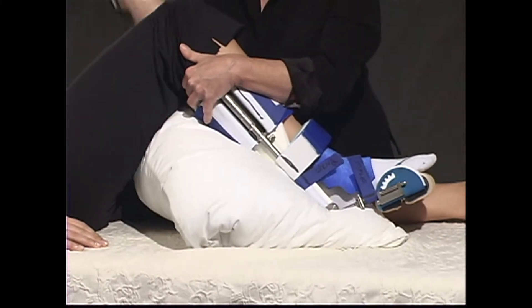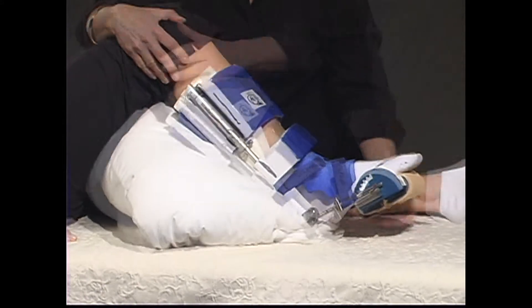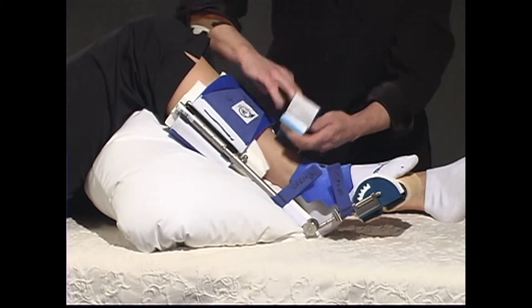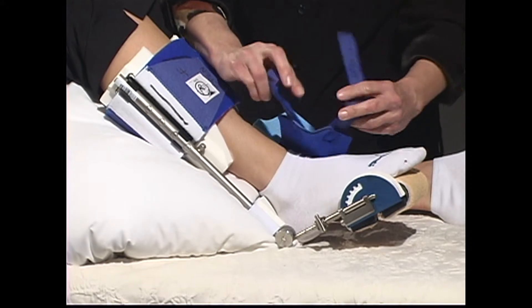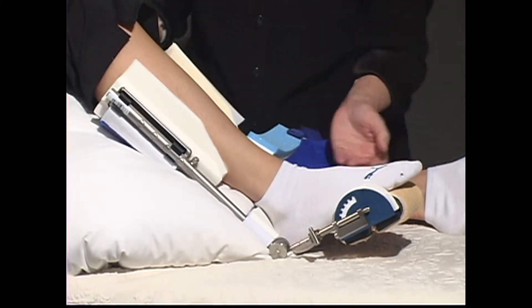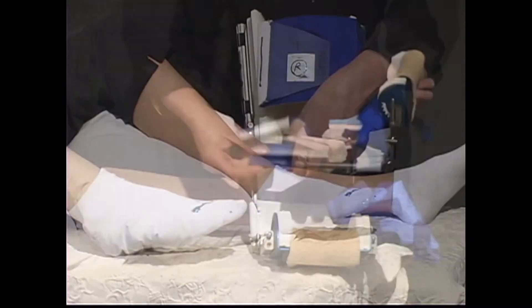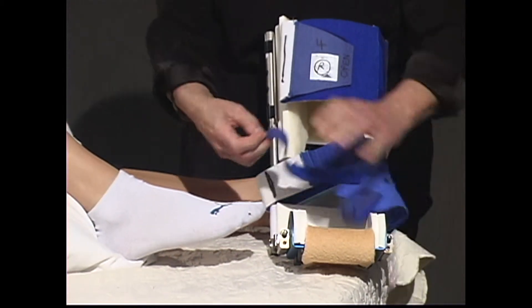Place a pillow under the patient's calf to float the heel. To remove the ankle DynaSplint, follow the numbers marked on each cuff by the sales consultant: first, the 2-inch shin strap, then the top thin blue butterfly strap, then the lower thin blue butterfly strap, finally the large shin cuff. Gently remove the patient's foot and ankle from the DynaSplint. Please reclose all straps and cuffs when the DynaSplint is not in use.